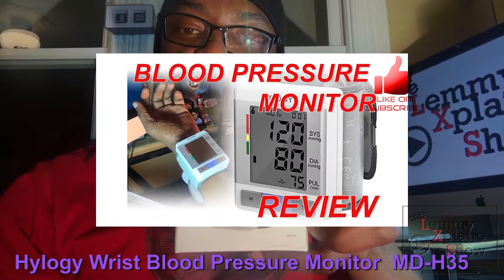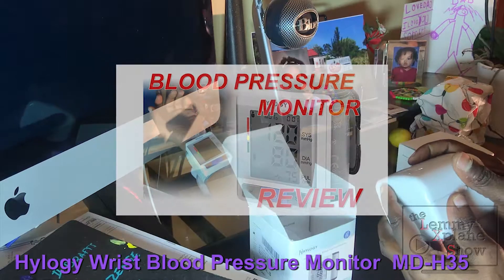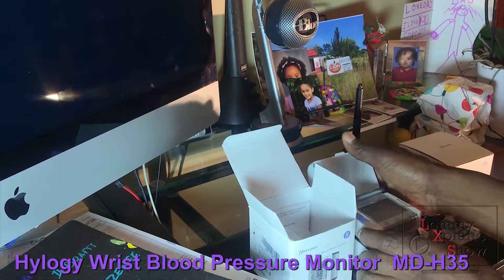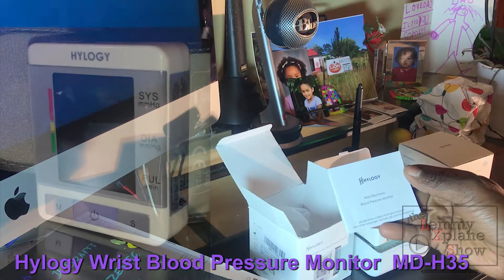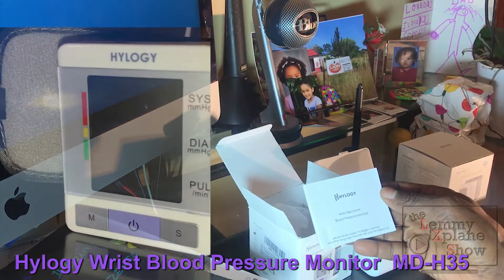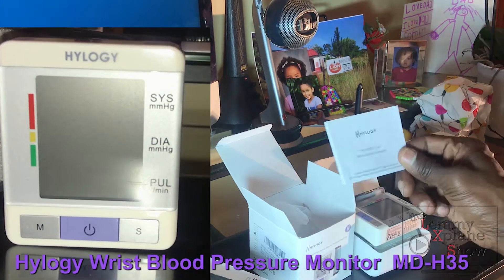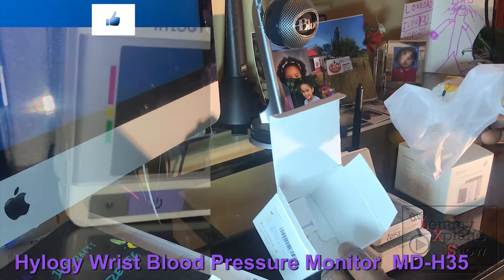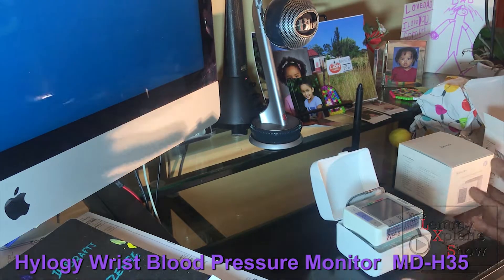Out of the box we have the storage case, which contains the blood pressure monitor itself. We also have the manual, which I recommend people take the time to really go through, because it can be quite tricky to use if you haven't read the manual. We also have a warranty card, so I'll put that aside.